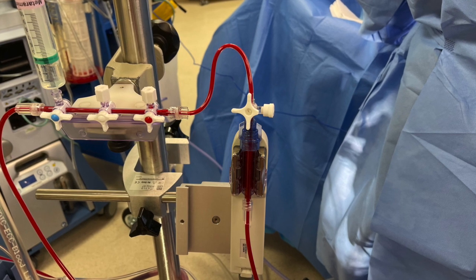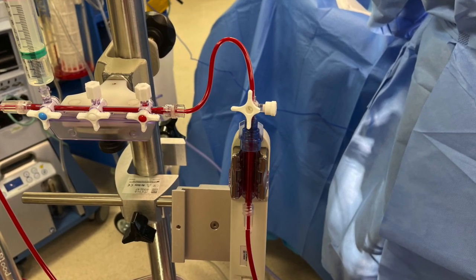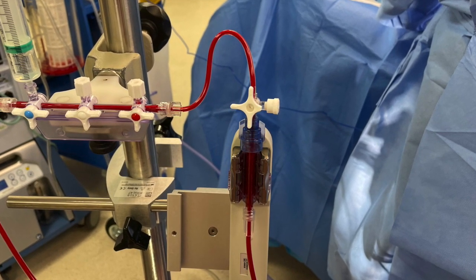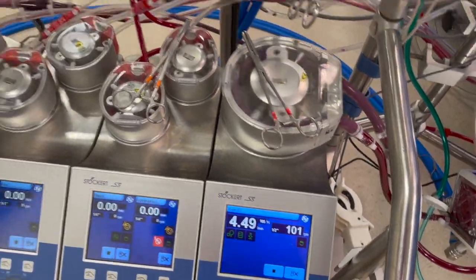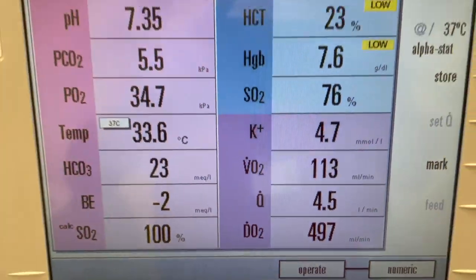A minimum flow of 35 ml per minute is necessary for proper measurement. Flows below the minimum may result in slower time response. CO2 and pCO2 can be displayed in millimeters of mercury or kilopascals, of your choice.